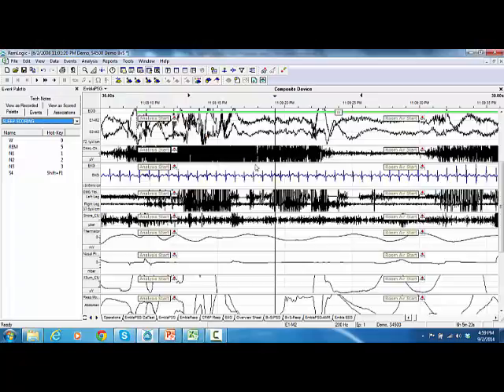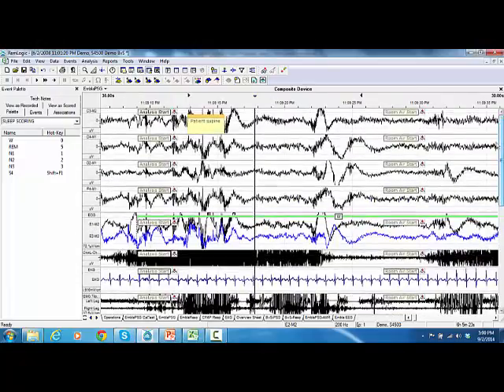Single right-click on the work pad area and press the hotkey in order to assign a sleep stage per each 30-second epoch.